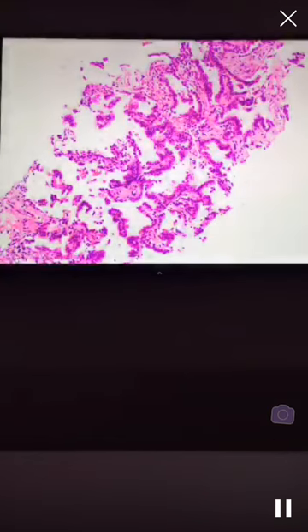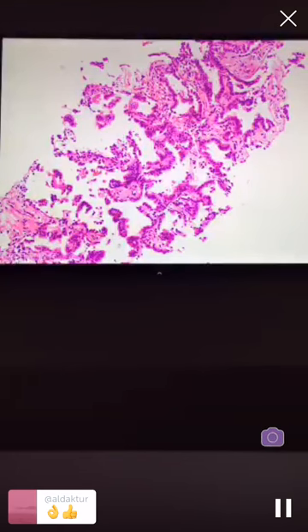Next, please. So this is the kind of tumor that I'm talking about. Some people, especially experienced lung pathologists, will see this and say adenocarcinoma, just easy. But I find that many people who don't look at a lot of lung find this kind of thing very distressing. This is not an overtly malignant thing for some people.